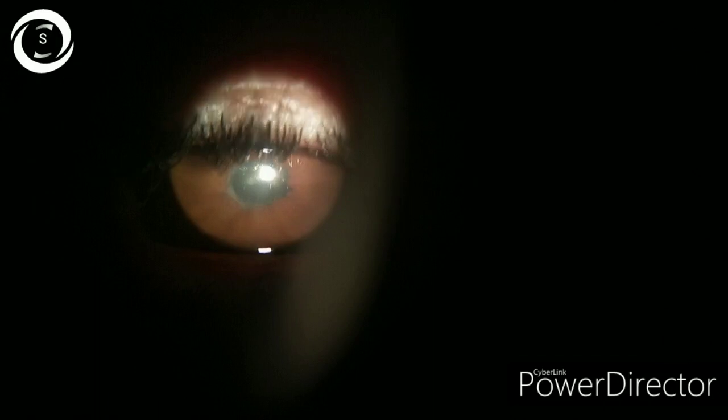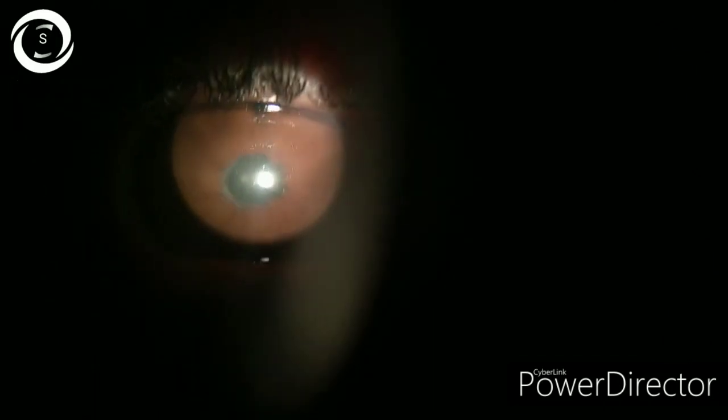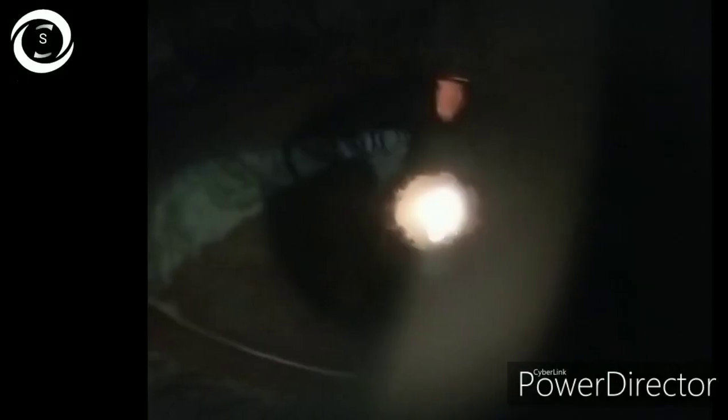This trans illumination technique also tells you about the intraocular foreign body path in the iris. So trans illumination technique can tell you about a number of ocular conditions and it is very easy to master — you just have to pass all the light into the pupil and it will highlight the pathology.